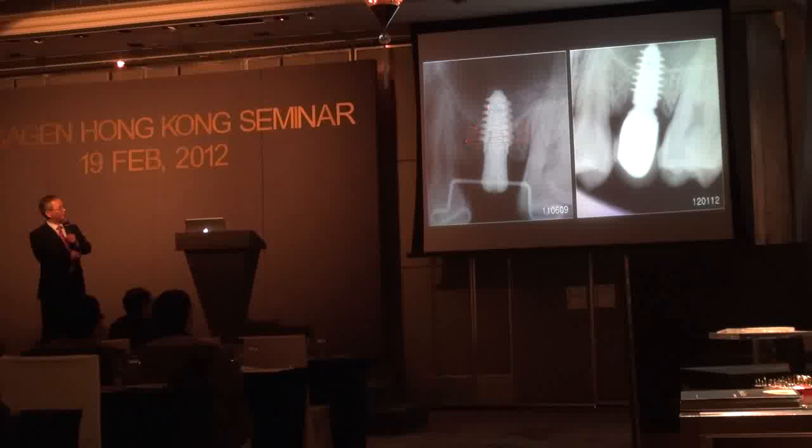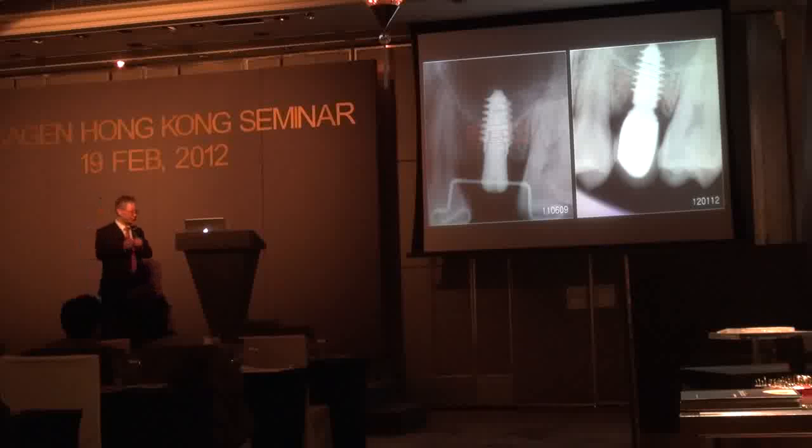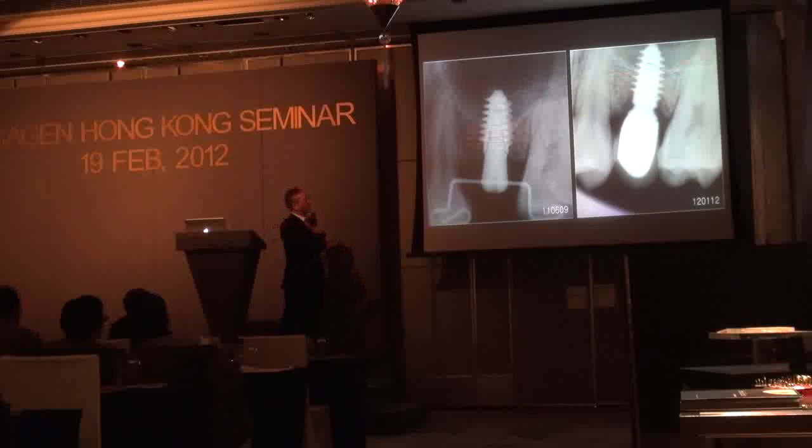After finishing the final restoration of the case, I saw the X-rays, and I was surprised a little bit. When I placed the implant, I just had 4 millimeter, 4 threads in the bone. But after finishing, above these 4 threads of bone, I had 3 more. That means I had more bone here. It's because of the implant surface. The implant surface is very bone attractive, osteoconductive. So usually you will find more bone growth above the sinus floor.